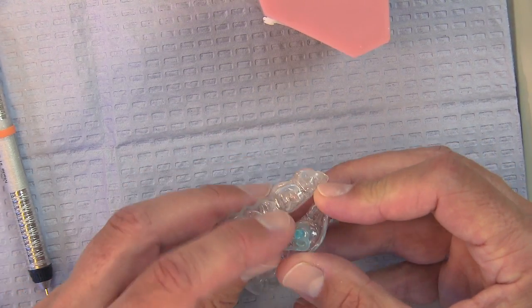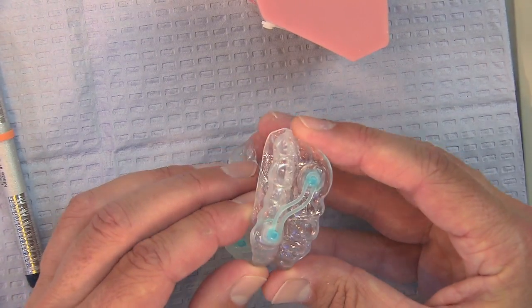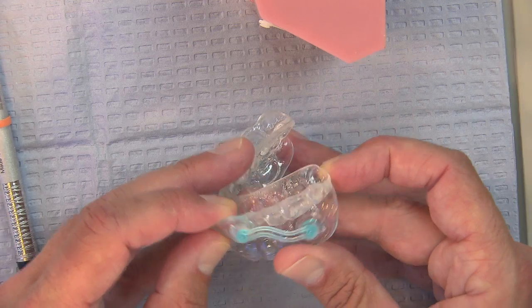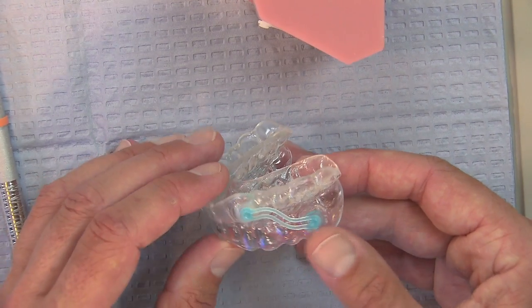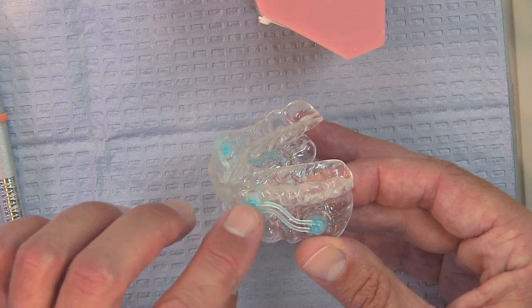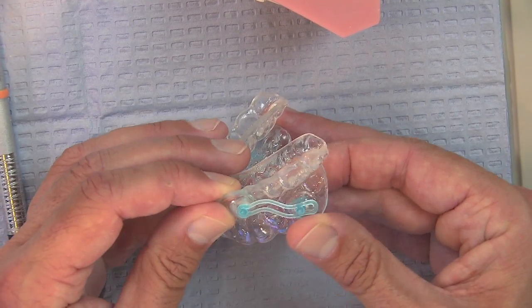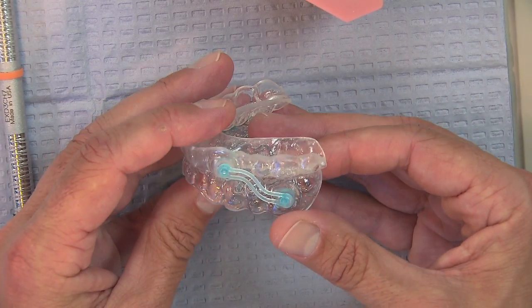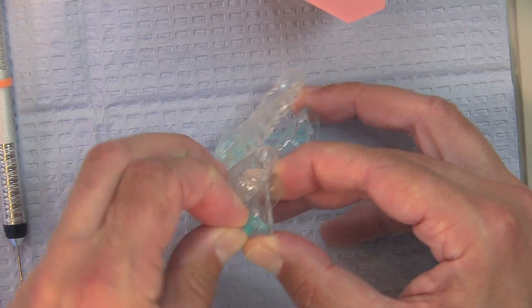It locks in on the upper one and it slides on the lower one, and one of the benefits of that is that it actually gives the patient a little more movement than they've had before in a couple different areas. So you have to actually physically take it off with your fingers to unhook it, but it stays rigidly connected to the Slide Link connector on the upper, and then it'll move on the mandible as you see back and forth like that. So it's very easy for the patient to actually change this at home.